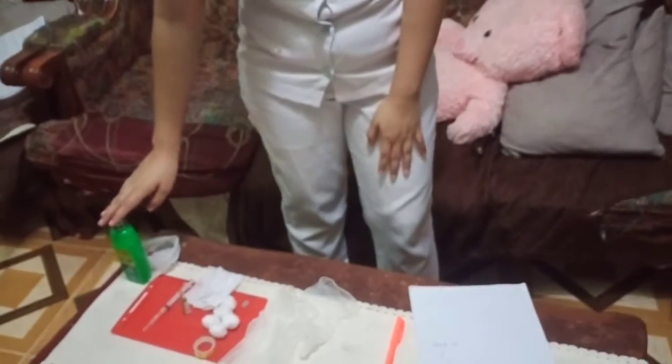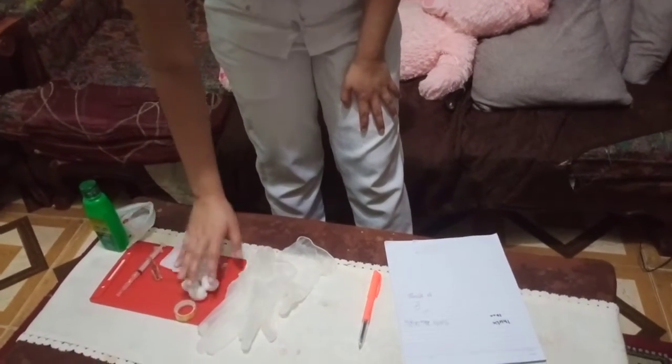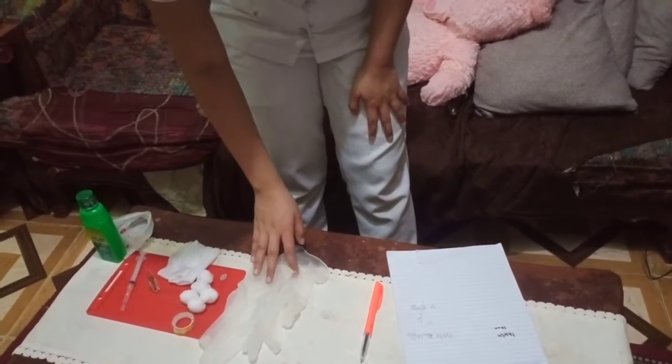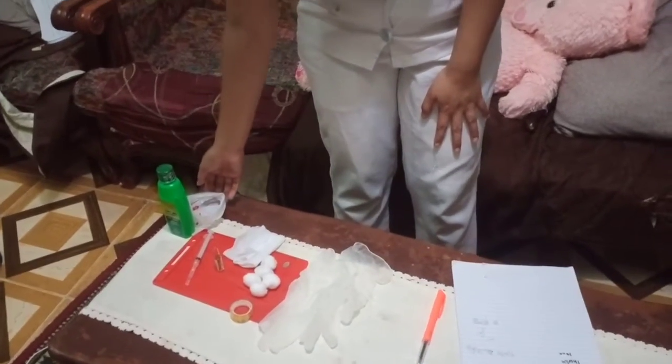So now we're going to organize the equipment to save time and effort. So we have alcohol, syringe, ampule, cotton balls, pad, gloves, and, assuming, a band-aid, then a trash can. So now we're going to prepare the medication from ampules.